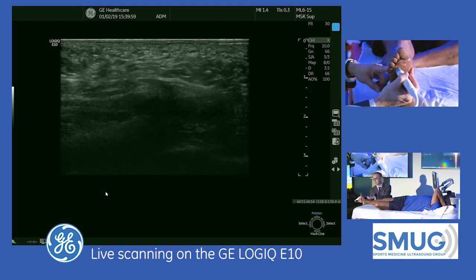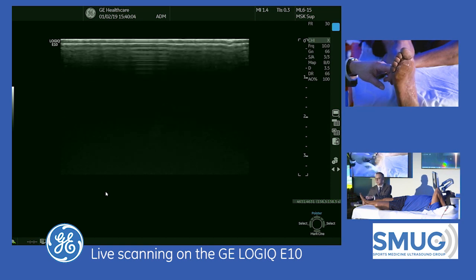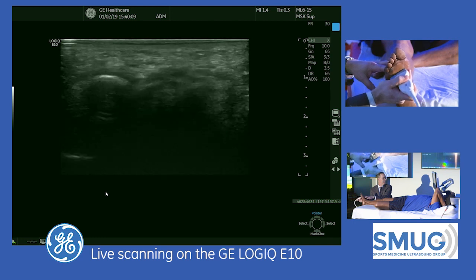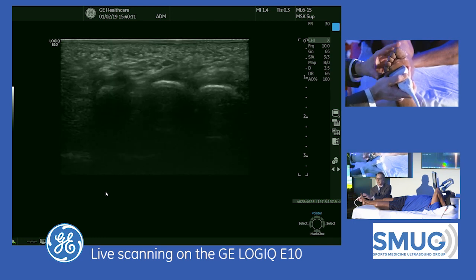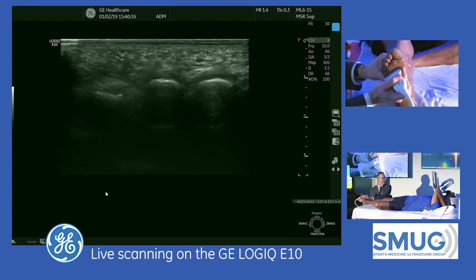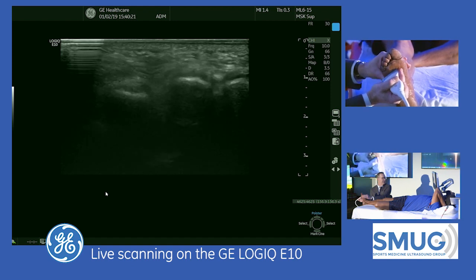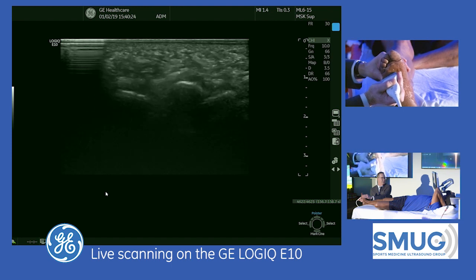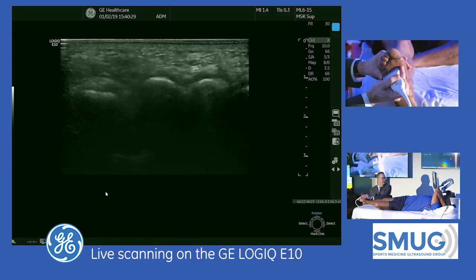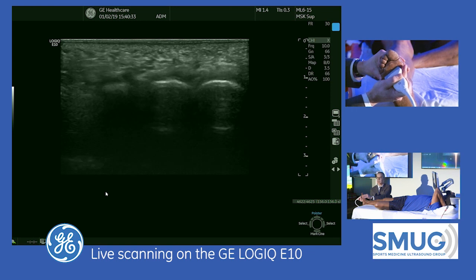Step three is the Mulder maneuver. Coming back to the same space with medial on the right side of the image, I'm going to squeeze from side to side at the center of the metatarsal heads. You'll see the normal heterogeneous fibro-fatty tissue moving in a plantar direction — that's normal. If you had a neuroma, it would be more obvious as it would be located in that tissue moving more plantar. That's how I look for a Morton's neuroma.